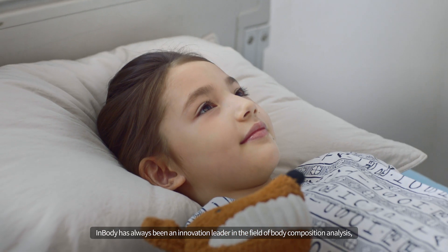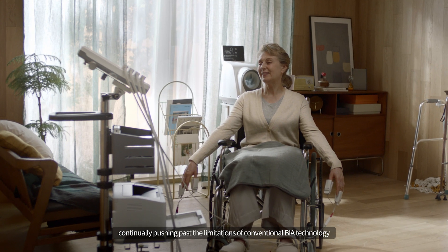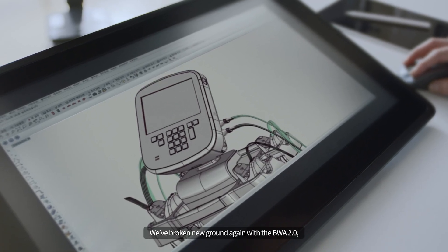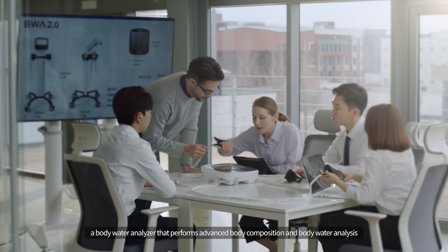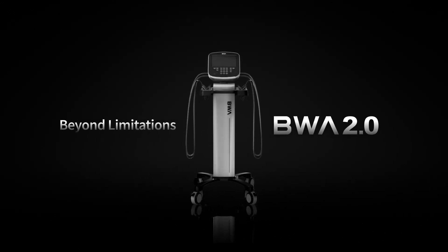InBody has always been an innovation leader in the field of body composition analysis, continually pushing past the limitations of conventional BIA technology. We've broken new ground again with the BWA 2.0, a body water analyzer that performs advanced body composition and body water analysis. Beyond limitations — the BWA 2.0.